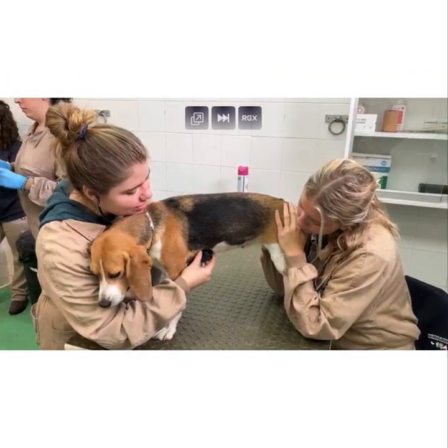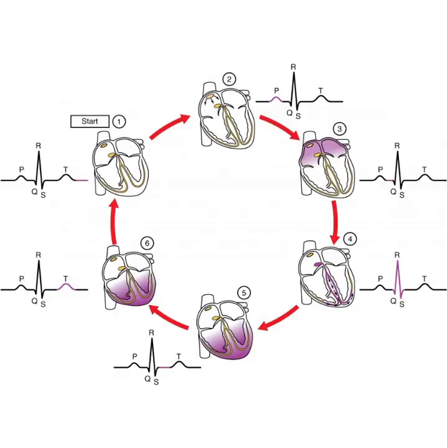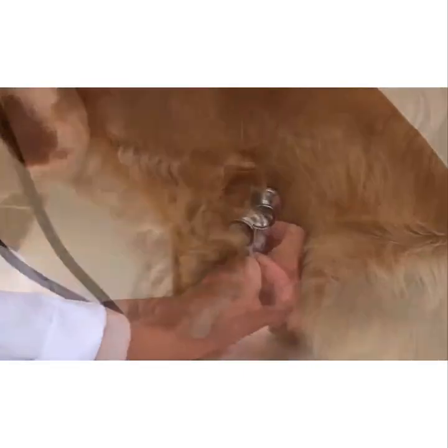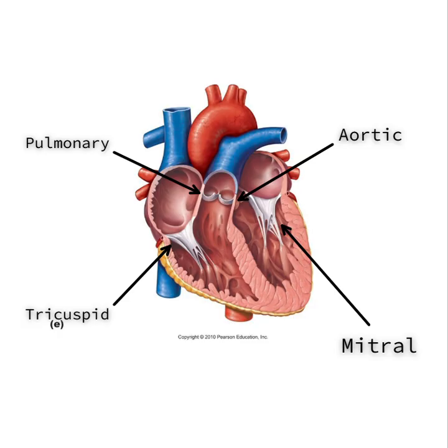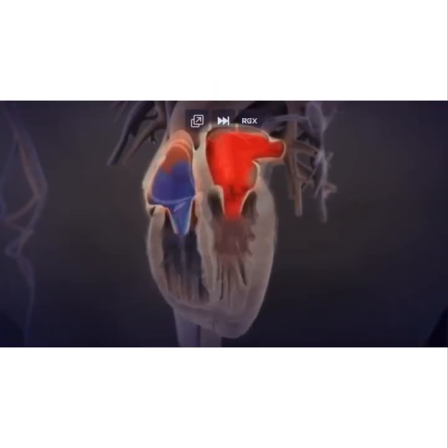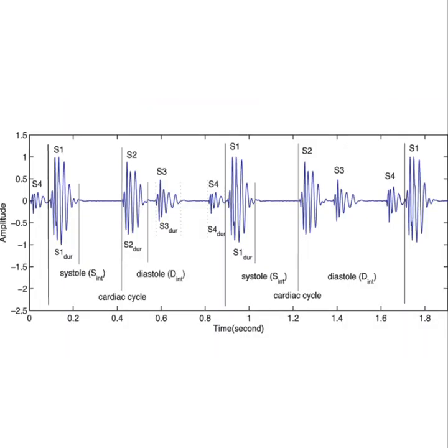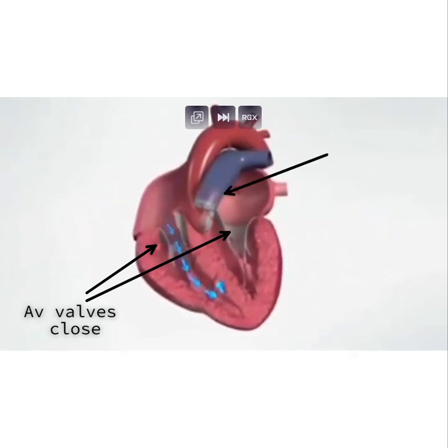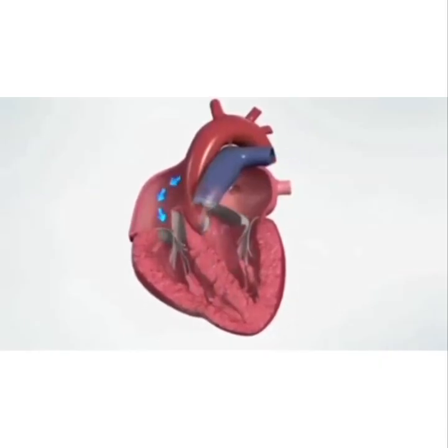Cardiac auscultation is a key clinical skill used to evaluate the mechanical activity of the heart by listening to its sound using a stethoscope. This test focuses on assessing the function of the heart valves and the rhythmic pattern of the heartbeat. During auscultation, the student should first identify normal heart sounds, S1 and S2, which correspond to the closure of the atrioventricular and semilunar valves. These should occur in a regular rhythmic lub-dub pattern.